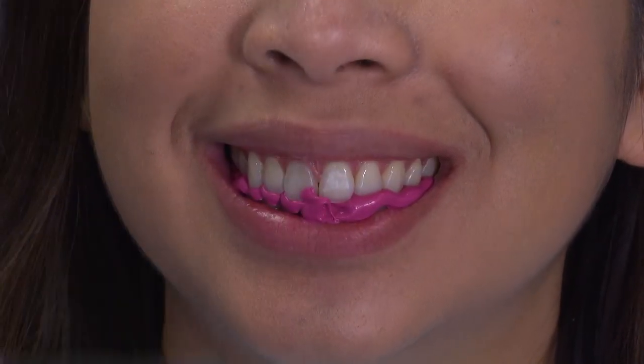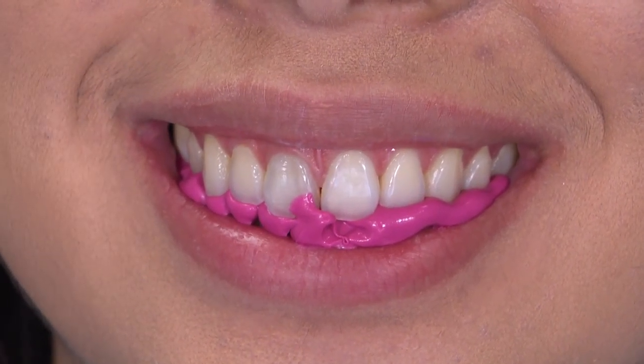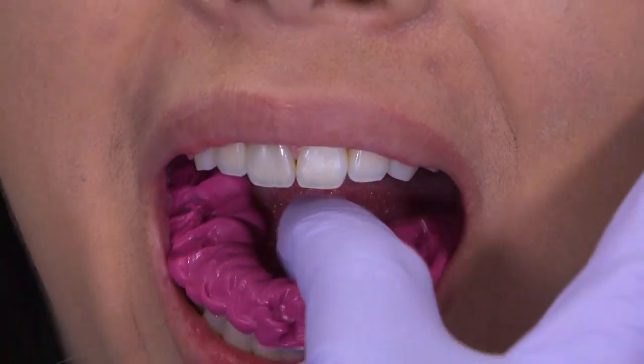The final step requires a bite registration of the patient's arches in centric occlusion. We do recommend the use of the Capture VPS Fast Oral Set Bite Registration Paste, spread out over the full arch, allowed to set, and then removed.